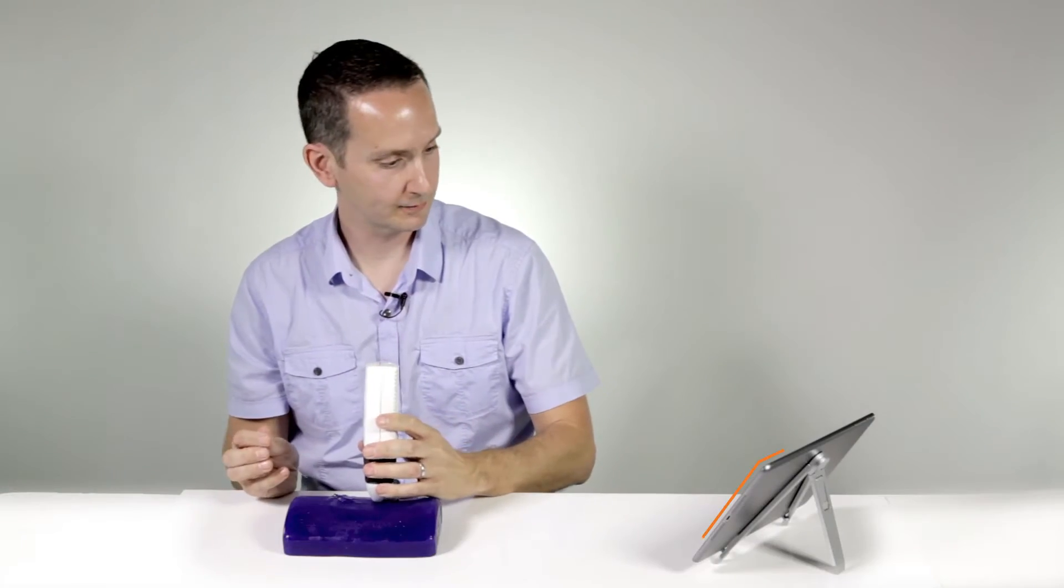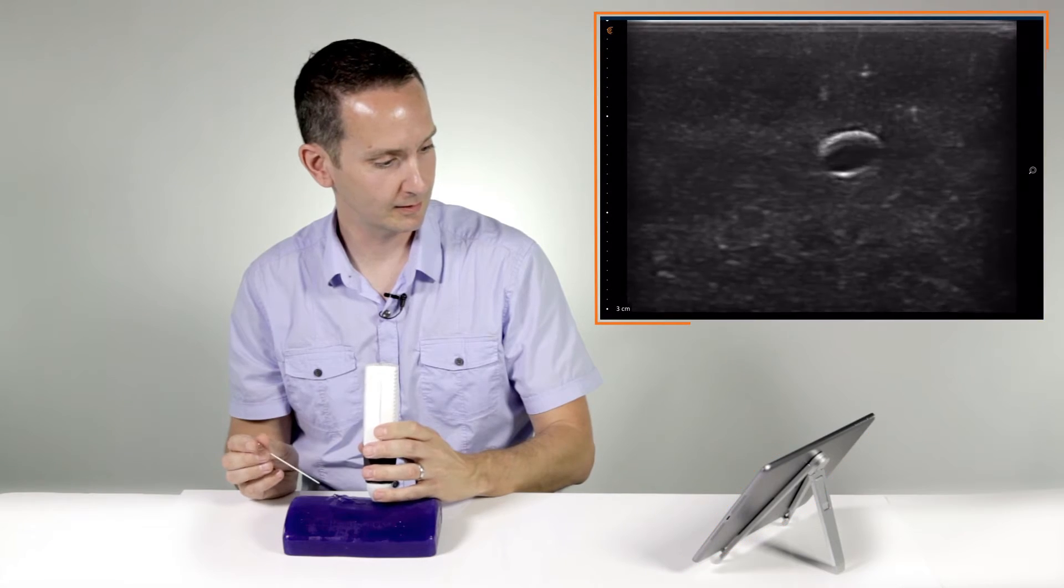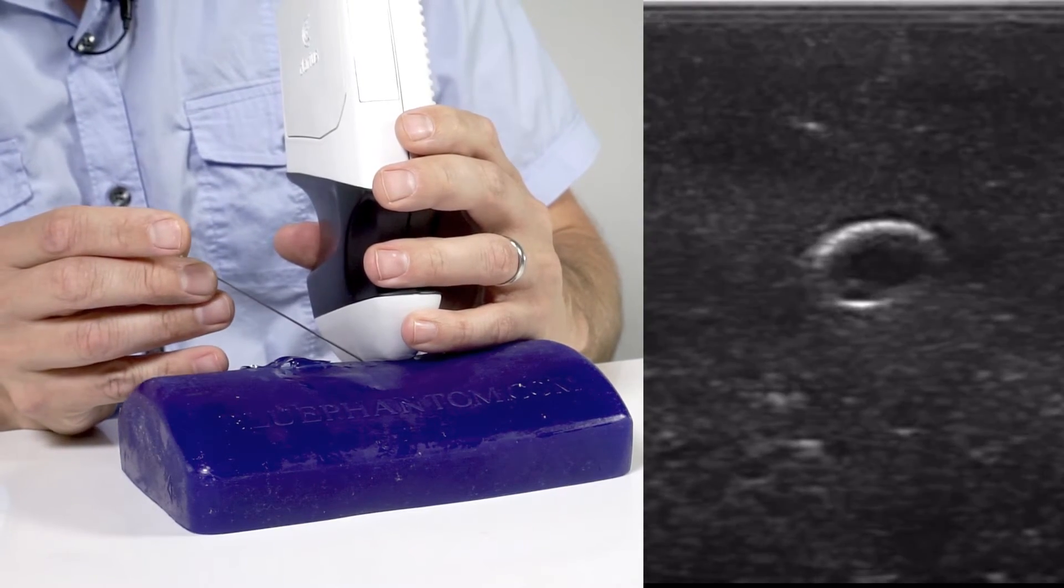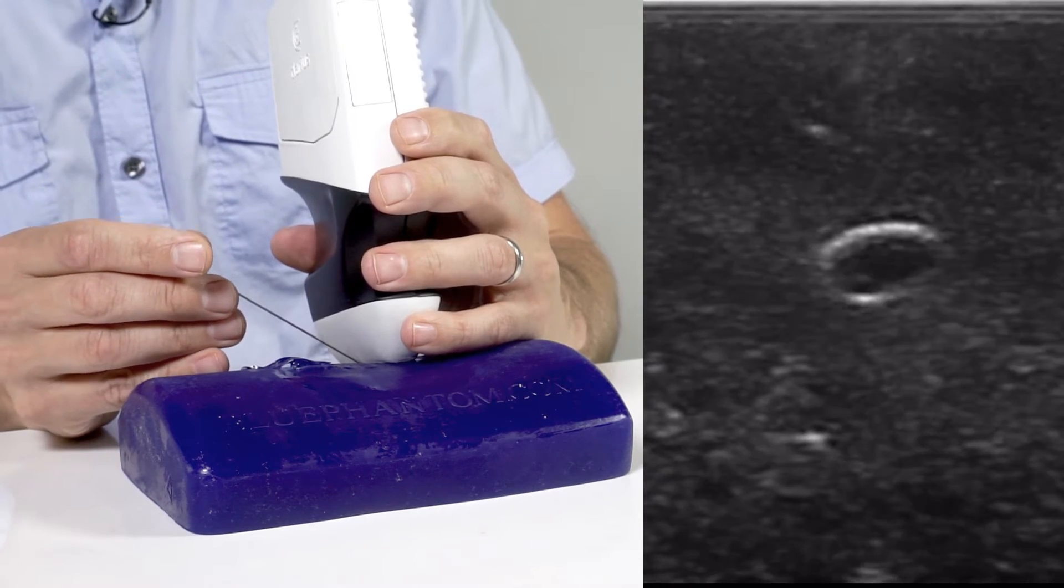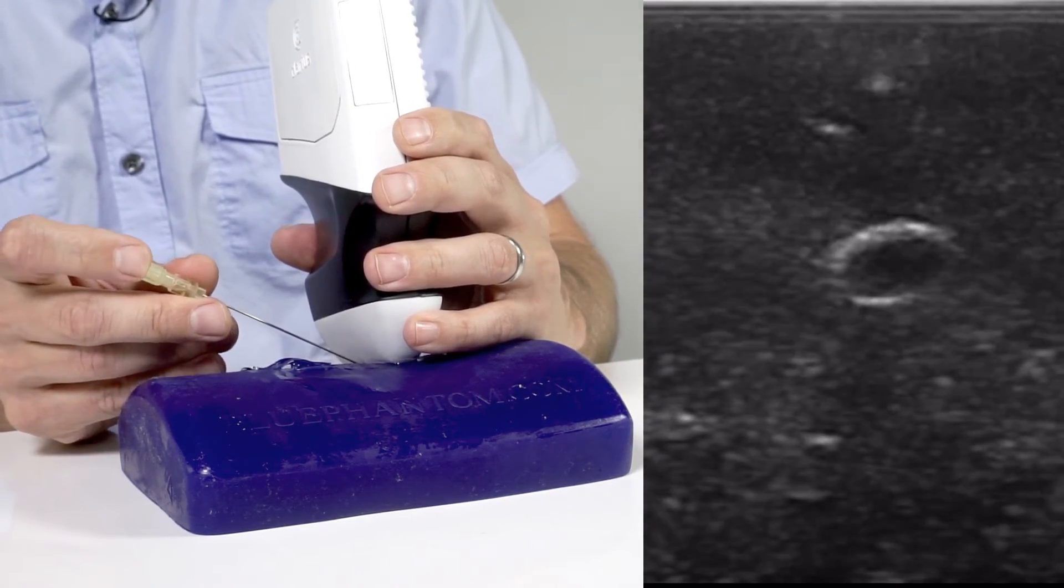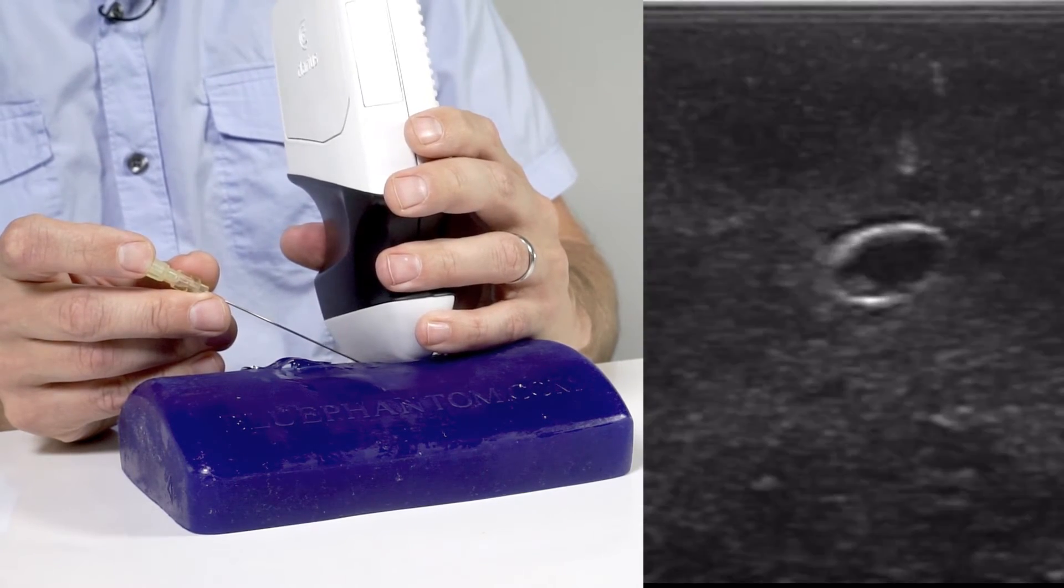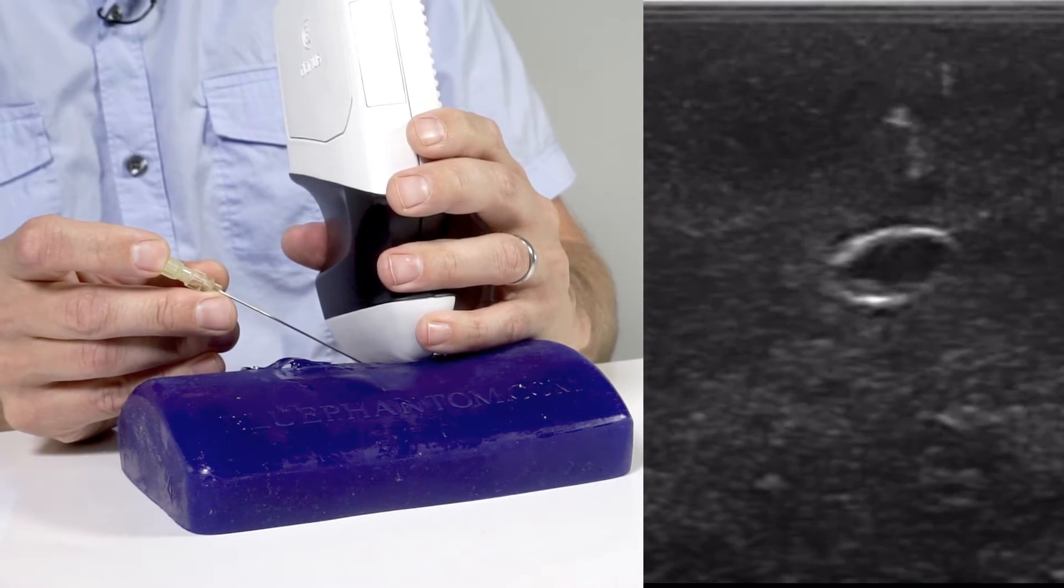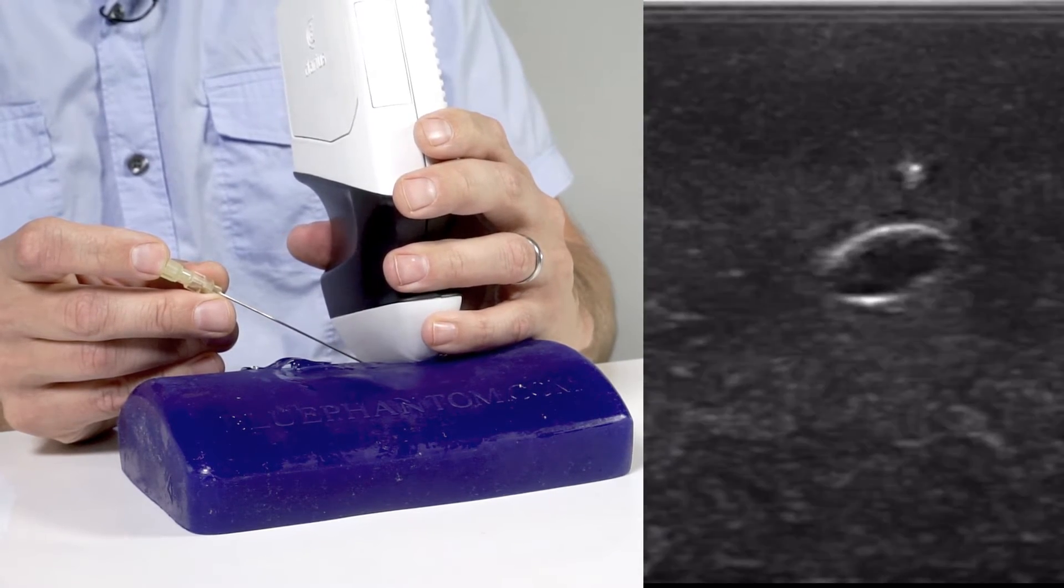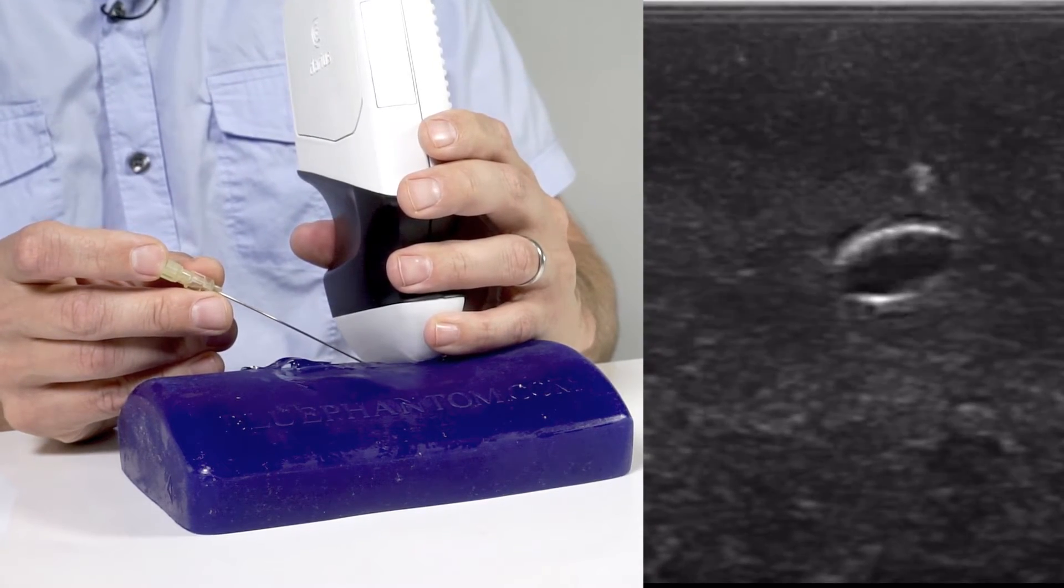With the short axis approach, I'm going to line the vessel up in the center of the screen, introduce the needle on about a 45 degree angle until I see the needle tip on the screen. I'm going to stop moving the needle. I'm going to slide or sweep the probe away from the needle. I'm going to advance it until I see the tip. I'm going to stop moving the needle. I'm going to advance or slide the probe away from the needle.